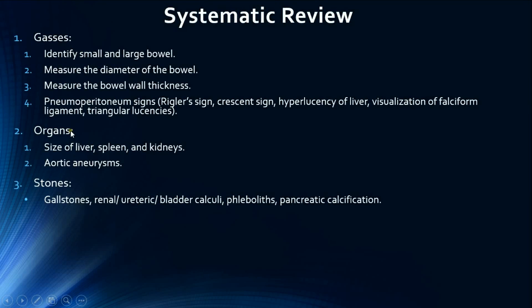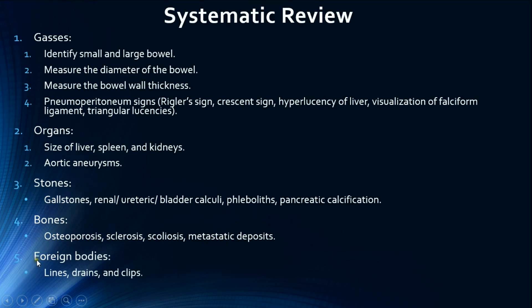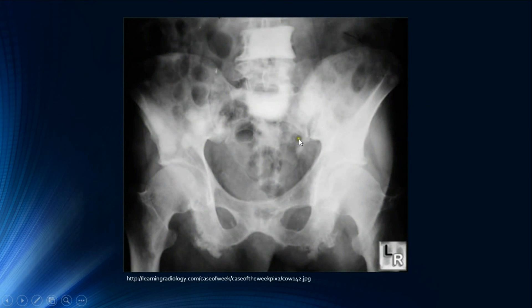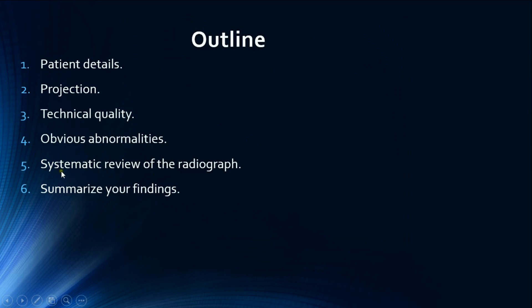Next — 'B' for bones — we assess the spine, pelvis, femoral joints, proximal femurs, and ribs, looking for osteoporosis, sclerosis, scoliosis, and metastatic deposits. Here is a radiograph showing multiple sclerotic, well-circumscribed round lesions in the pelvis and lumbar spine in a patient with prostate cancer. These are osteoblastic metastatic deposits, which is characteristic of prostate cancer metastases.